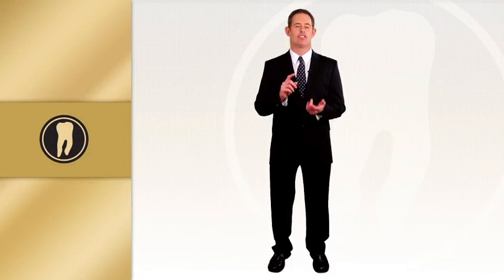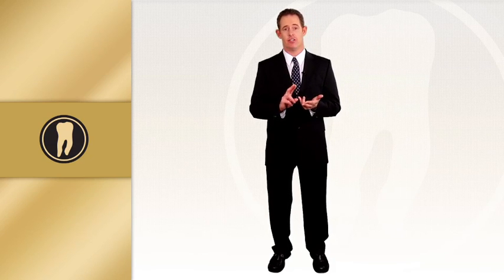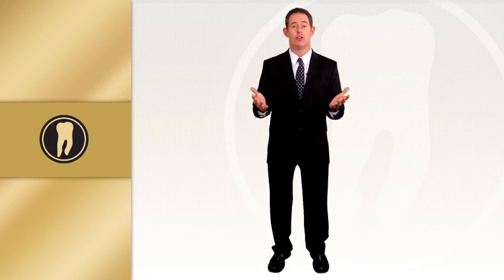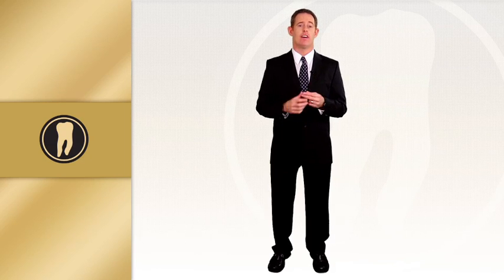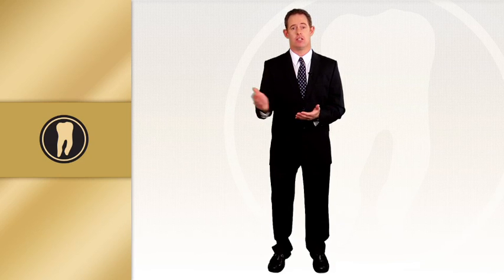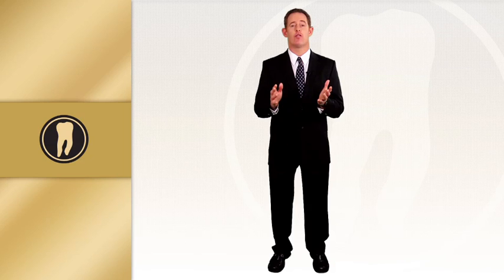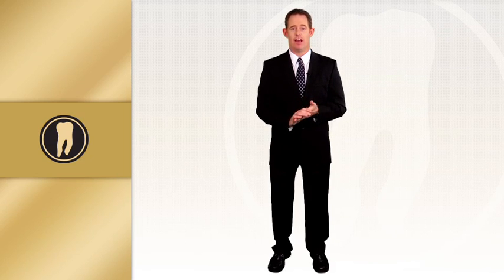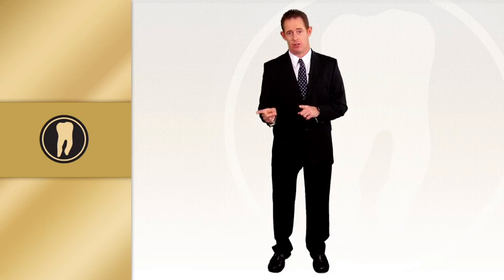So in review, I discussed the canal morphology of the maxillary anterior teeth and the mandibular anterior teeth, so you'll be familiar when you access those cases and know what to expect. Number 2, I talked about profound anesthesia, and I discussed the 2-carp rule. I recommend giving 2 carps on maxillary and mandibular cases, and that usually will get the patient profoundly numb. Third, I talked about rubber dam placement, and my favorite rubber dam clamp is the number 9 clamp. That will work 99% of the time on maxillary cases and mandibular anterior cases.